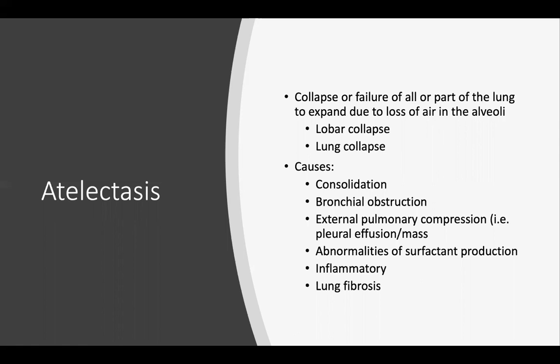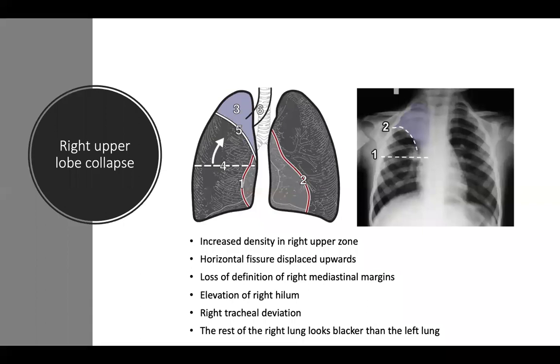Other etiologies may be inflammatory such as TB or fungal infection, and lung fibrosis. The previous film showed right upper lobe atelectasis. Radiographic features include increased density in the right upper zone, horizontal fissure displaced upwards, loss of definition of right mediastinal margins, elevation of the right hilum, right tracheal deviation, and the rest of the lung appearing blacker than the left lung.